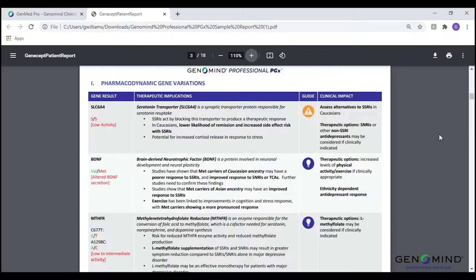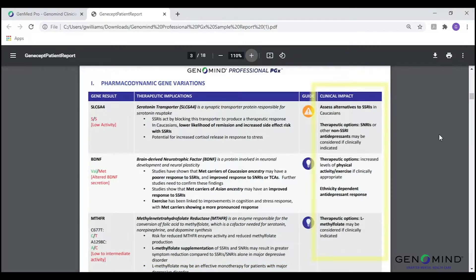Moving into the center and right of the page, you will see the therapeutic implications and clinical impact columns. In these sections of the report, we provide more in-depth information about the gene itself and the implications a specific genotype may have, as well as the clinical applicability of this information. This information is further highlighted with intuitive icons signaling alert or caution or pharmacogenetic guided options in the guide tab.